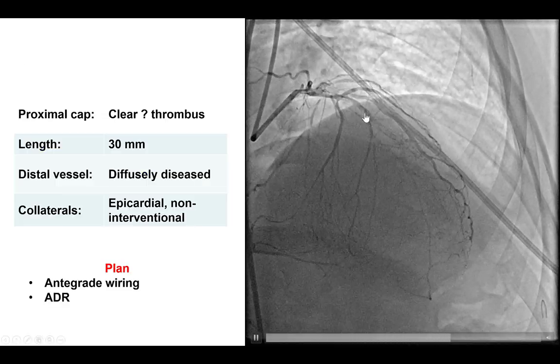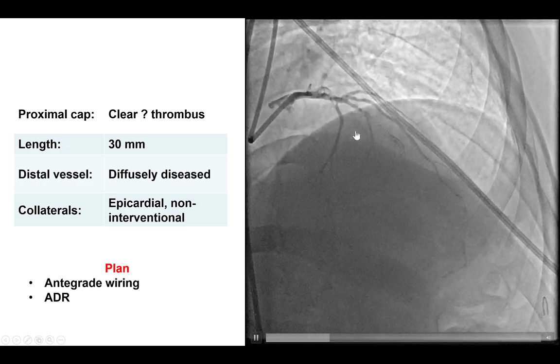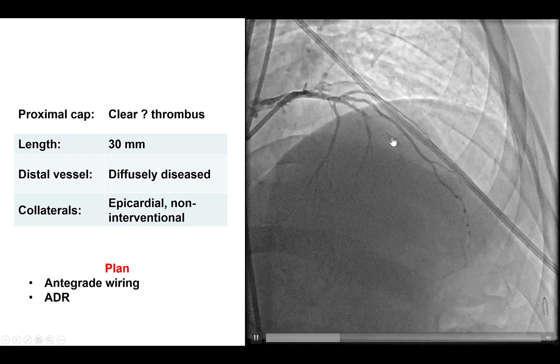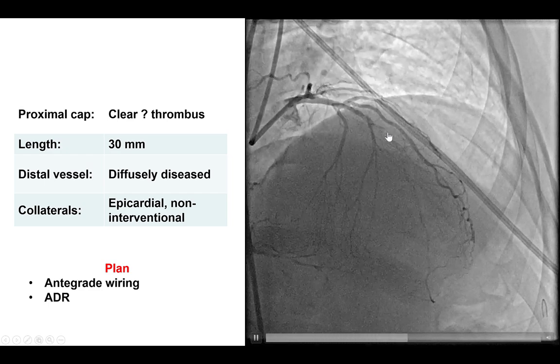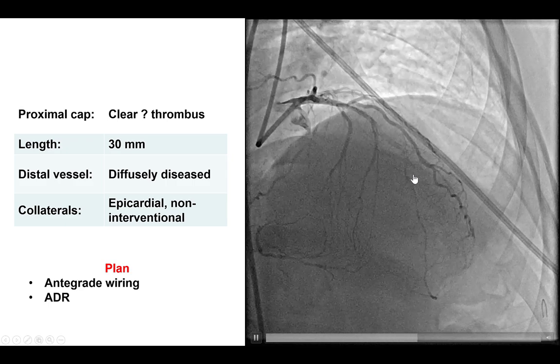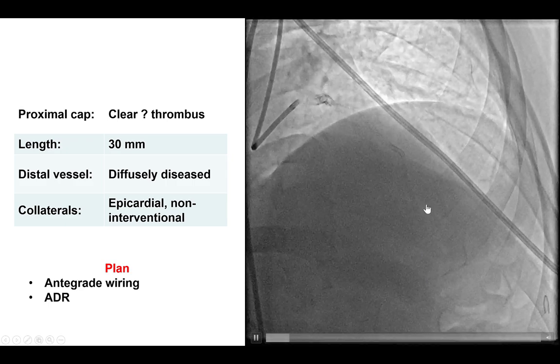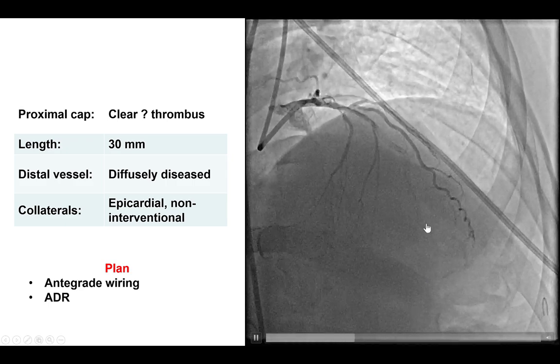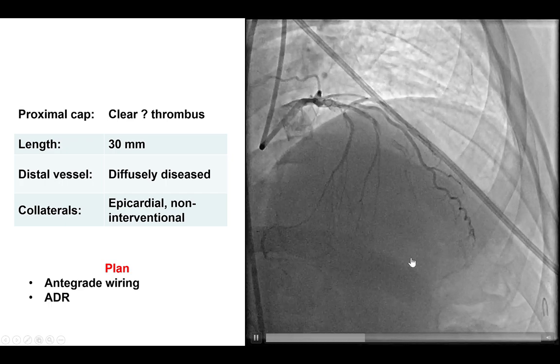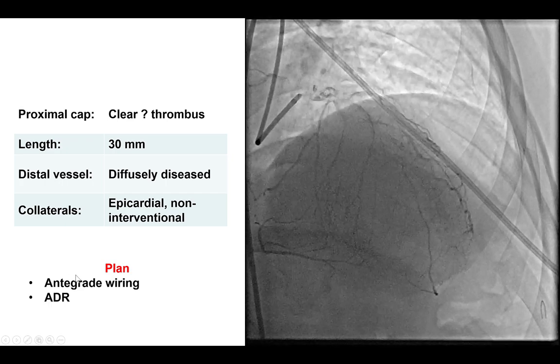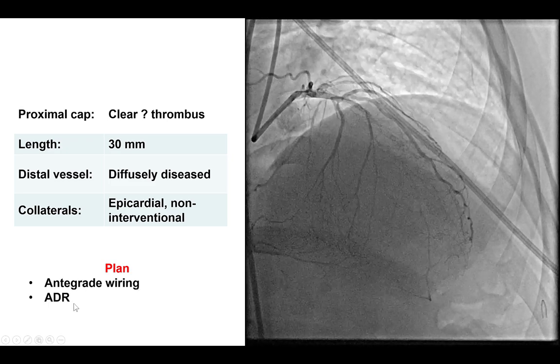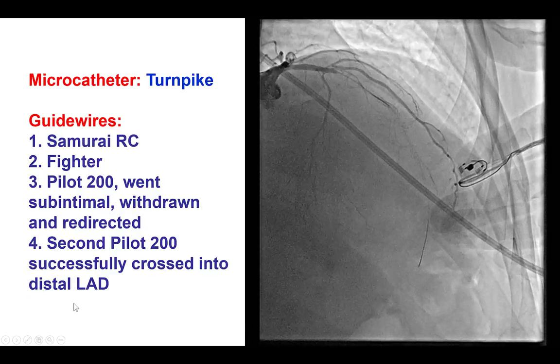There is a well-defined proximal cap. There is a filling defect, suggesting that this may not be a CTO but actually an acute occlusion. The length of the in-stent occlusion is about 30 mm. The distal vessel is diffusely diseased but is filling through ipsilateral collaterals. However, those collaterals do not seem to be appropriate for the retrograde approach. Therefore, the plan was to attempt antegrade wiring followed by antegrade dissection re-entry.